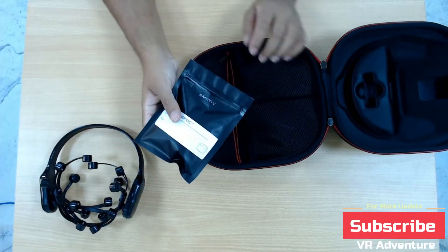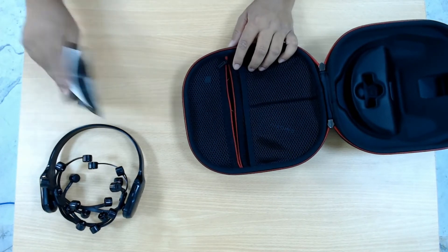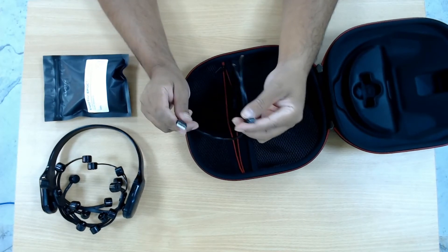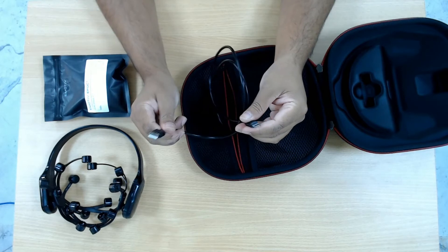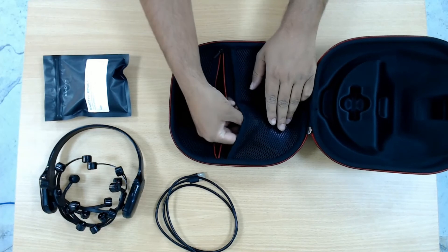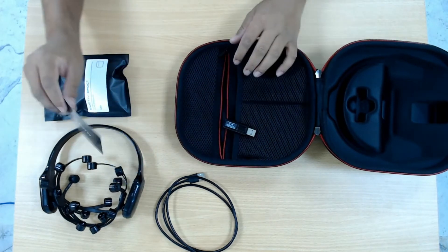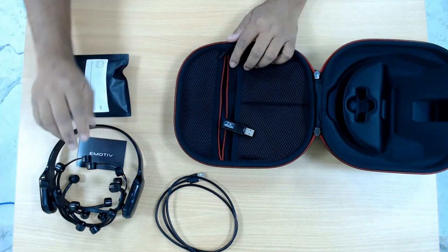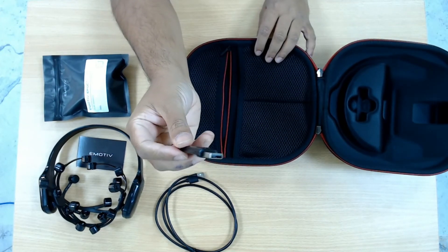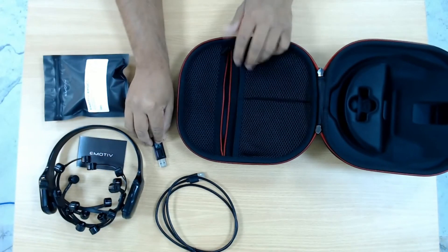There may be more than 14 pads provided because they might get damaged or dirty, so they can be replaced. There are pouches inside for all these plugs. There is also a cable to charge the headset — one side is USB Type-C for the device and the other is a standard USB cable, so you can charge it via any adapter or from your computer. There is also a company card from Emotiv with a serial number for the device — it's important to keep this for future reference. Finally, there is a special Bluetooth USB connector that will be used to communicate with the PC wirelessly, and you need to plug this in before starting to use the headset.